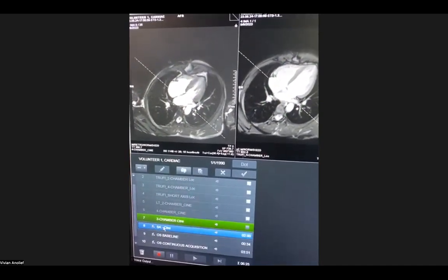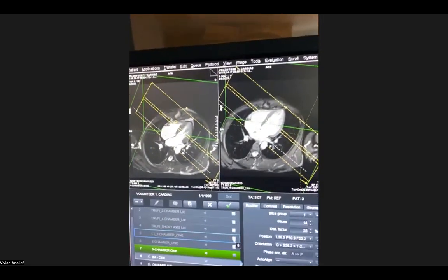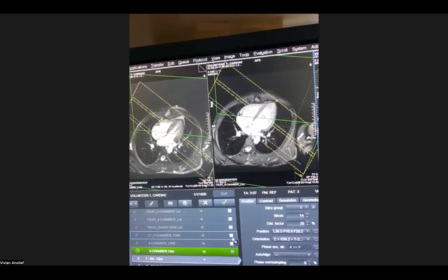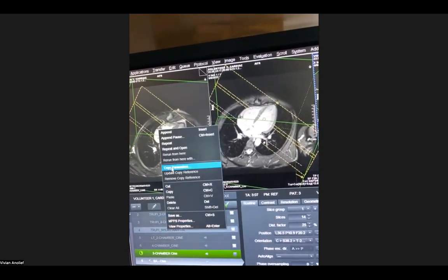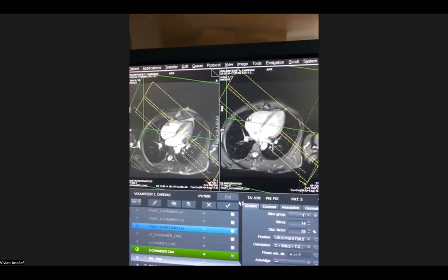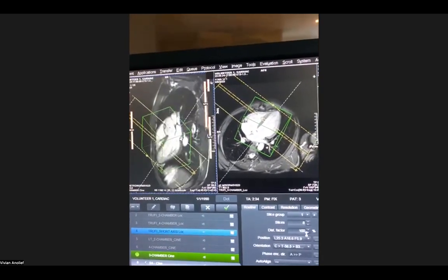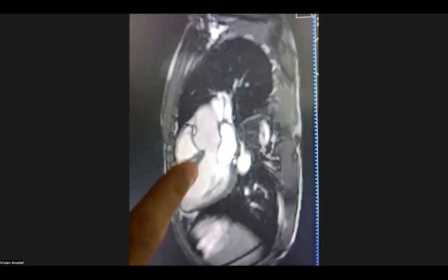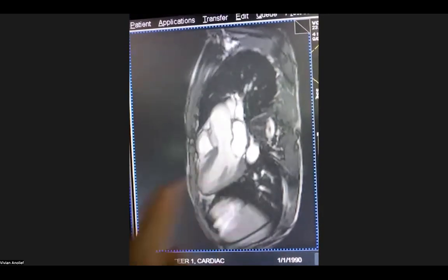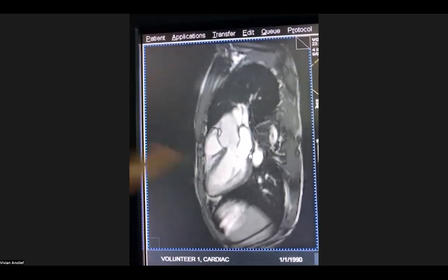Next, the short axis stack. So this is going to be the same thing. He starts copying his slices and adjustment values from his short axis localizer. And now he's going to adjust it based on his cine, so both his 2-chamber and his 4-chamber. So you see here, you have a nice 3-chamber. You have the aorta, left ventricle, left atrium, and you can see both valves, both the aortic valve and the mitral valve clearly. And over here, we have the right ventricle.